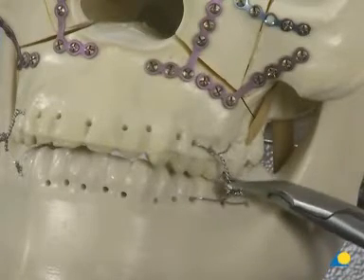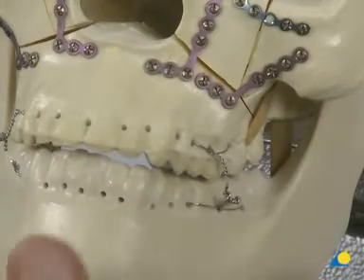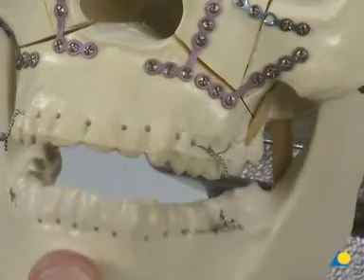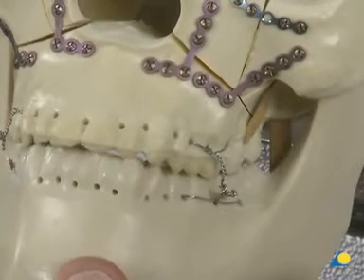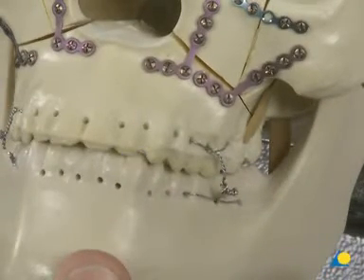Following the reduction of the LeFort I level, the MMF is removed and the occlusion is checked. The plating of the basic framework of the mid-face is now complete. It is important to note that the patient is allowed to function after this type of fixation.